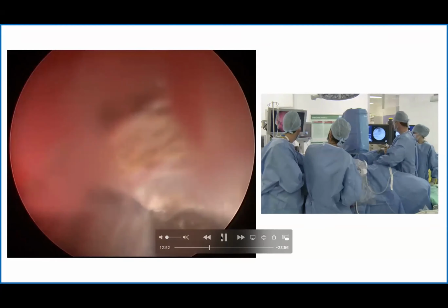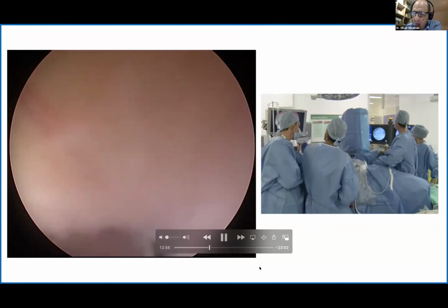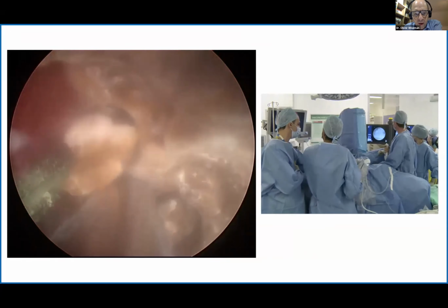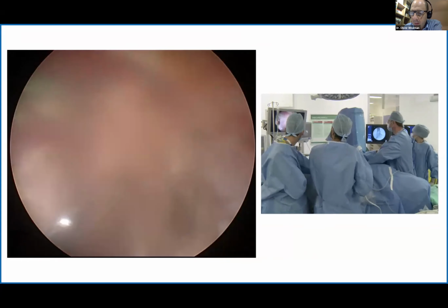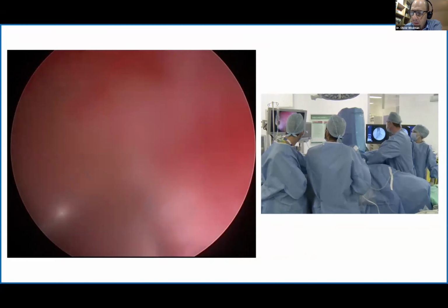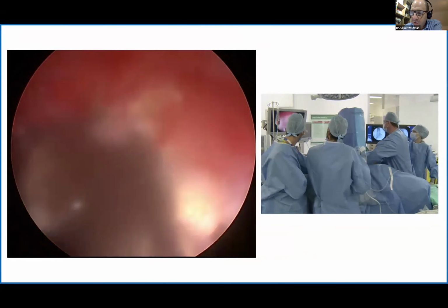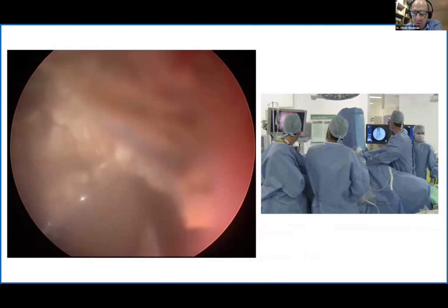So Kasra, can I just ask, what's your strategy for this stone? Is there a particular way you're planning to break it down, to remove it in a particular order? And what is Laurian going to be doing from below at the moment, because presumably the stone is occupying the pelvis up to the PUJ? So what's his contribution at the present time? Okay.